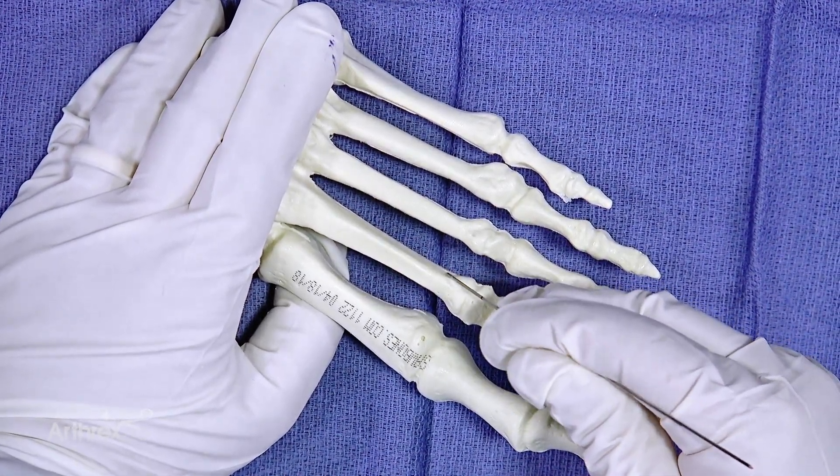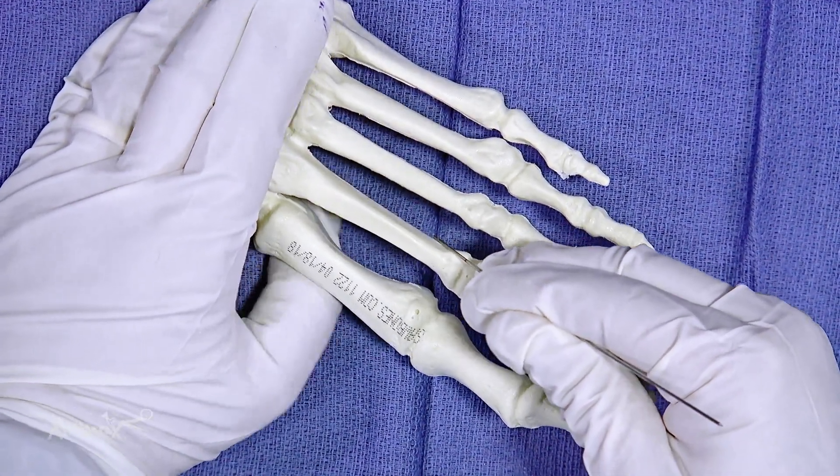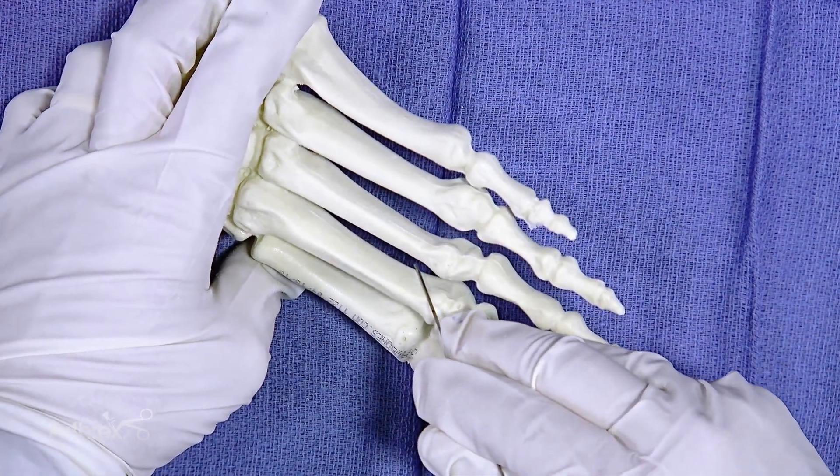We want to spread down bluntly alongside the metatarsal, and your trajectory is going to be at about 45 degrees, like so.